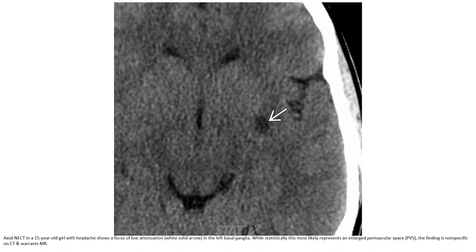Let's see the first case. This is a non-contrast CT of a 15-year-old with an incidental focus of low attenuation in the left basal ganglia. Statistically, this is most likely represented by a large perivascular space. The finding is nonspecific on CT and warrants an MRI.